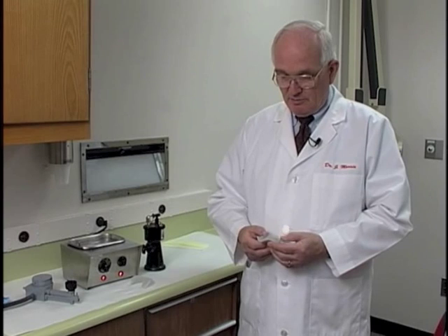Today's appointment we're going to be making final impressions. Since the last appointment we have made a set of custom trays from the primary impressions and casts that we poured from the primary impressions on the last appointment.